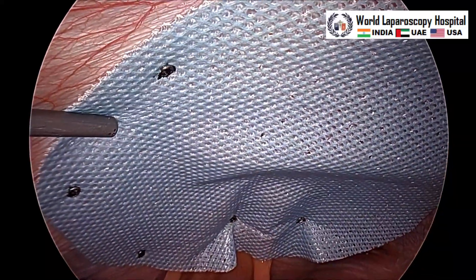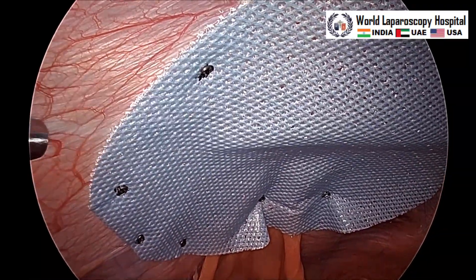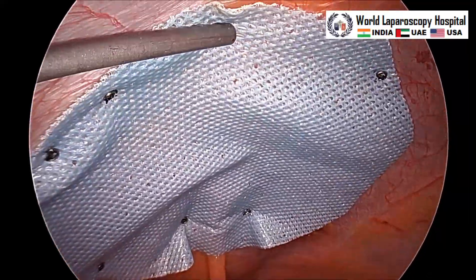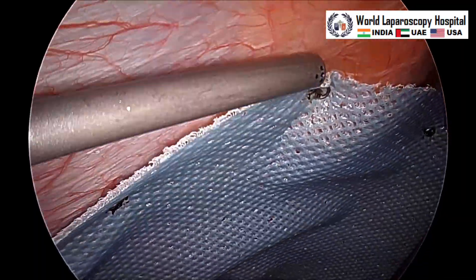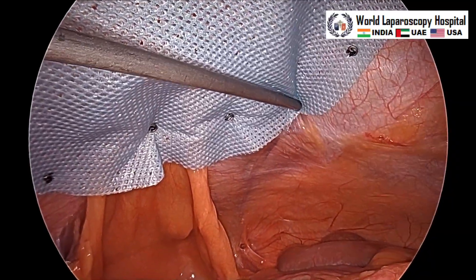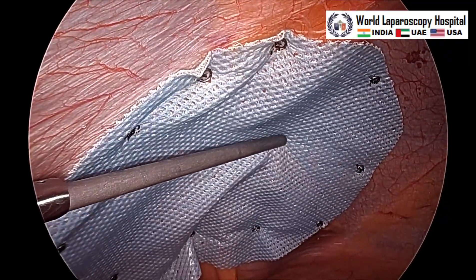In between both medial umbilical ligaments we are far away from the bladder, so the bladder is not in this area. This mesh is made for intraperitoneal application and it is a very conformable mesh — the lower side polyurethane does not adhere to the bowel. After the outer crowning, we will do a little inner crowning also — at least four on the margin of the defect — but no tacker should be fired over the defect. Outer crowning is done and now this is inner crowning.